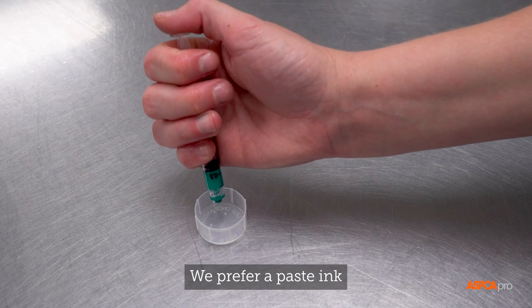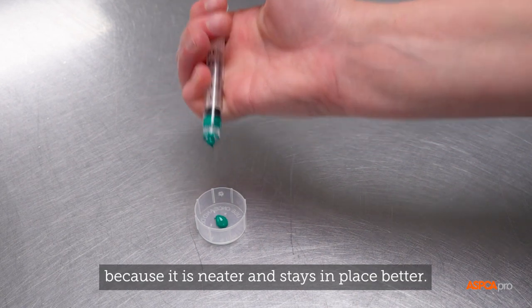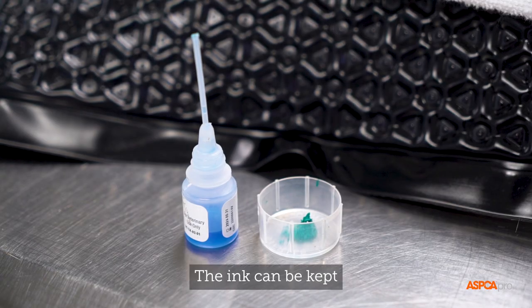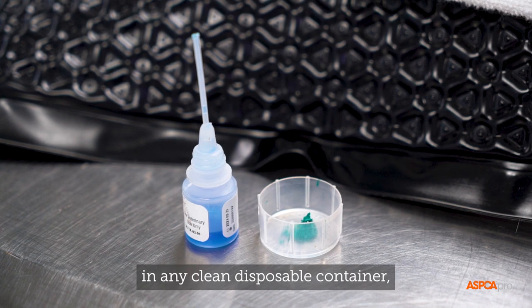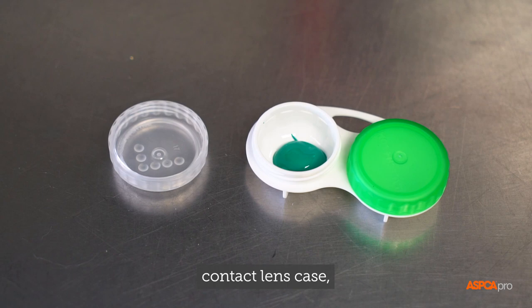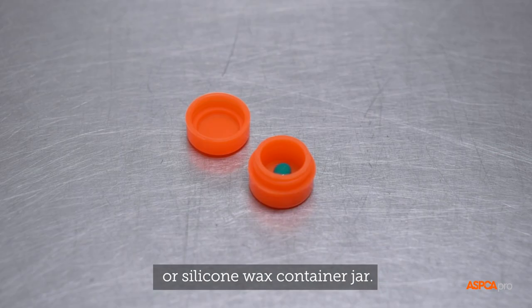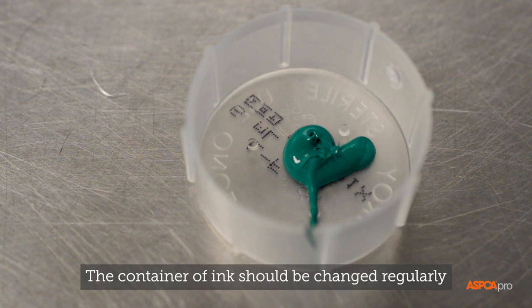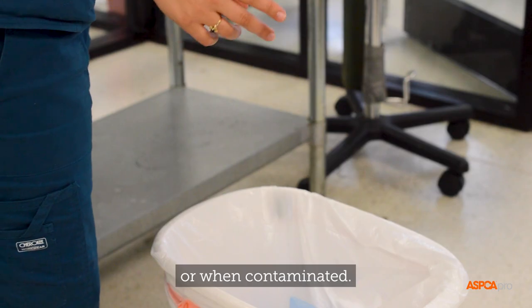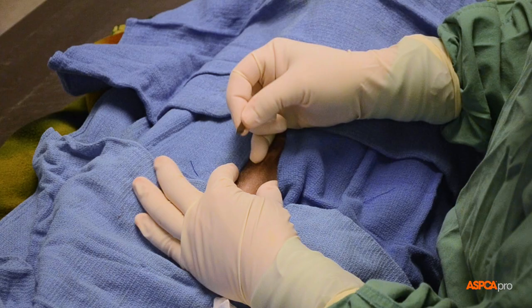We prefer paste ink rather than liquid ink because it is neater and stays in place better. The ink can be kept in any clean disposable container, such as the end of a syringe case, contact lens case, sterilized soda cap, or silicone wax container jar. The container of ink should be changed regularly or when contaminated.